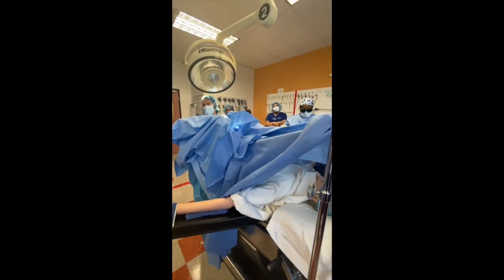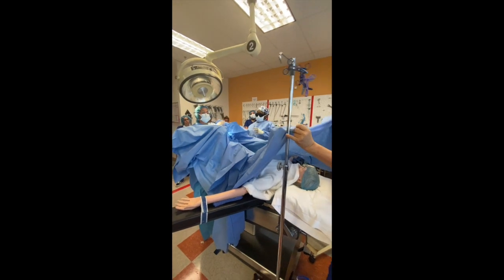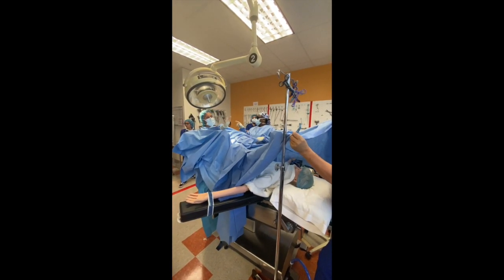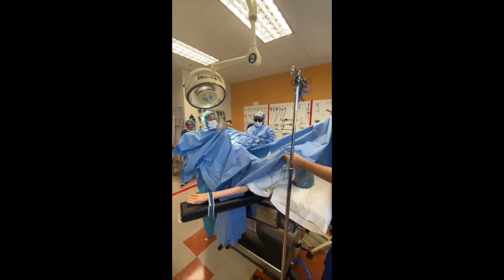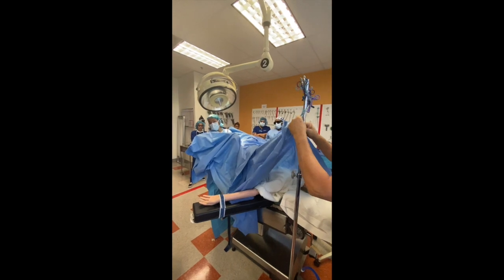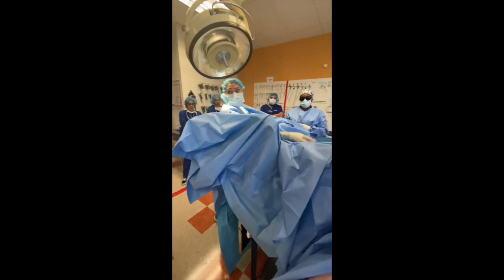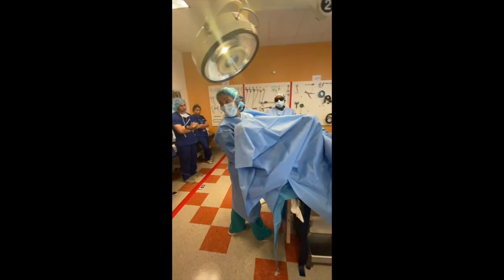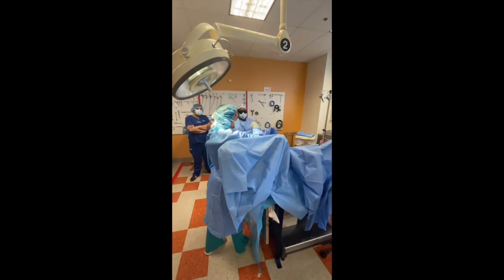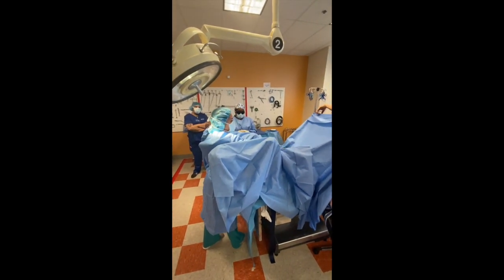I stay here. Because as that doctor is pulling, the whole sheet will move — the fenestration will be up here. I'm steady staying and keeping the fenestration at the perineum, because if it ends up up here and you drag it down, you've just contaminated everything. Nothing up here on the patient is sterile. So cuff, give to anesthesia, and remain holding here.